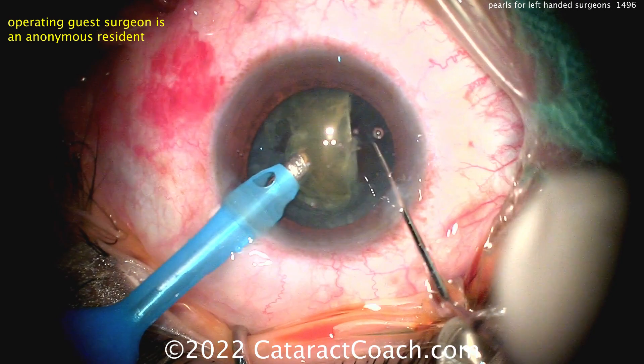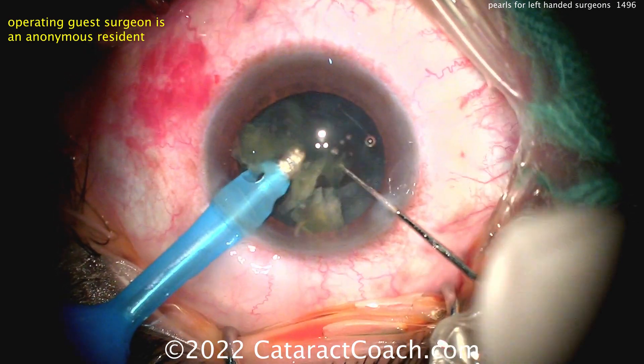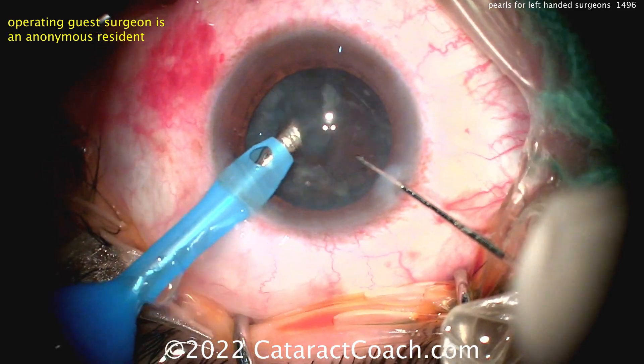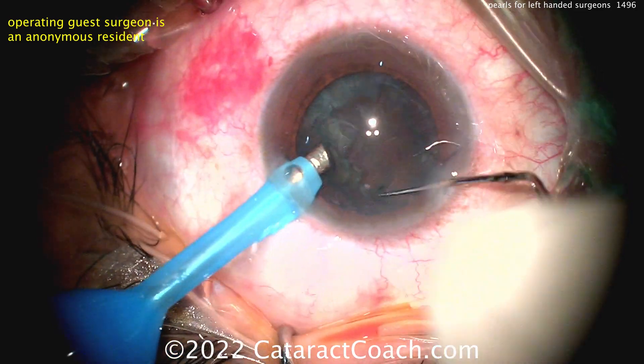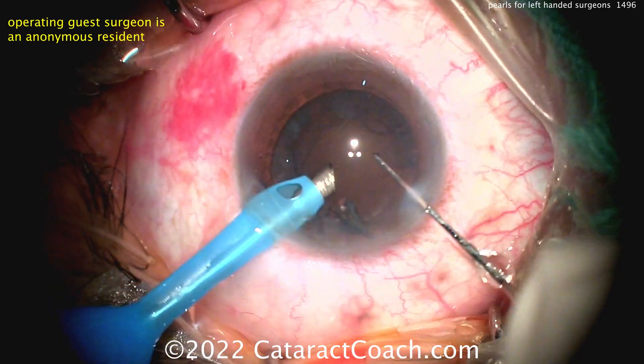You could also have this as a right-handed surgeon who decides to have the FACO probe in their non-dominant hand — because it's not going to do much work — and the chopper in the right. Regardless, this is something you need to practice. A good pearl, especially if you're a younger or just starting-out surgeon: you really need to use both hands very well.